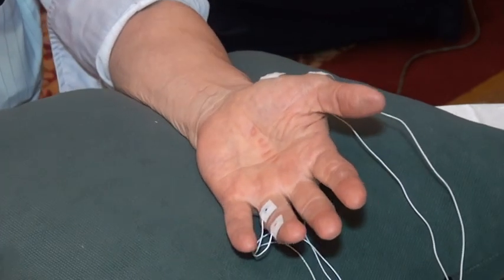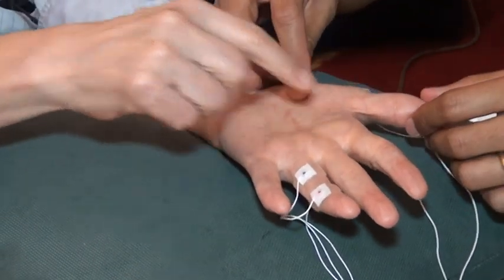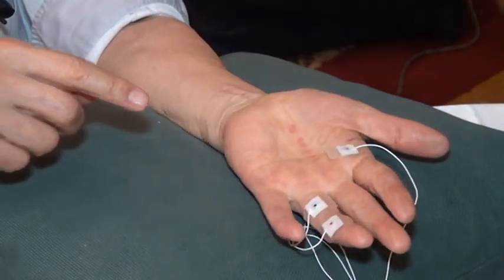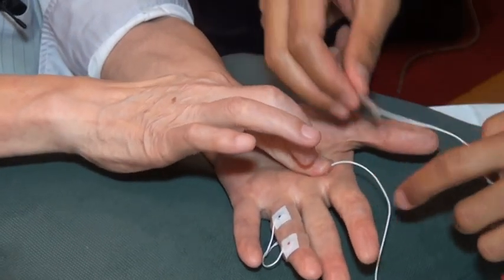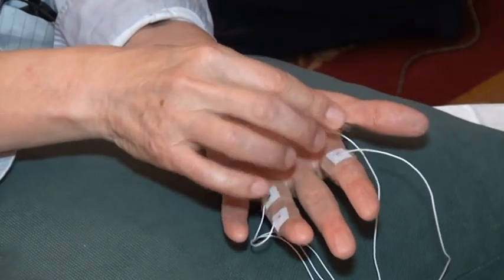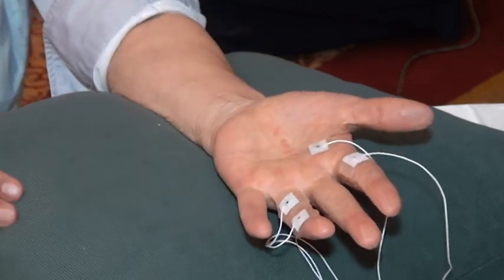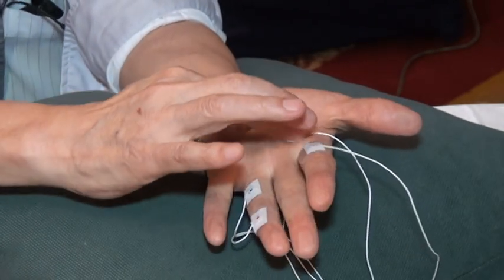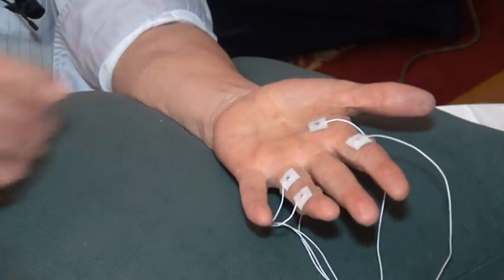All right, so much for that. Any question about this? Let's move to the lumbricals. Now I'll tell you another recording site for median nerve. That is the lumbrical. This is the Preston Shapiro technique, which I like, particularly for the inching technique.